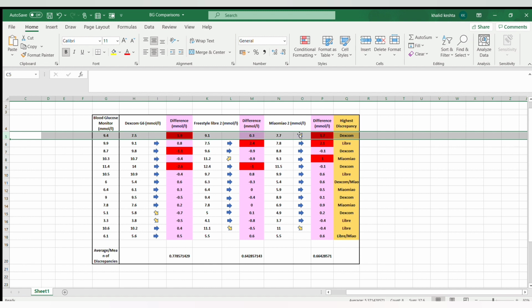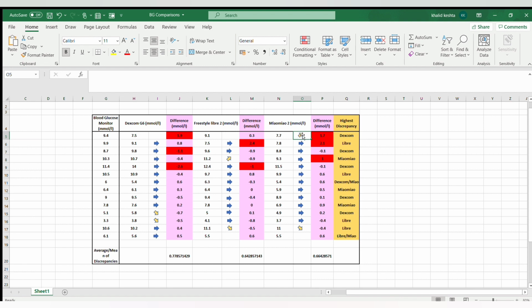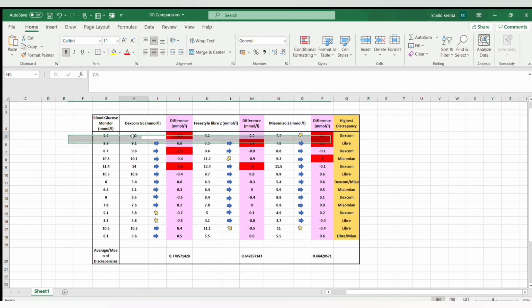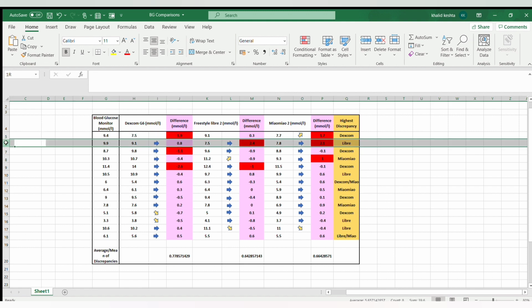But what the MIAOMIAO said is that the arrow is going up. So basically, as I said at the start of the video, the arrow dictates where this figure is going. So it's gonna go towards the 9.4. So the MIAOMIAO is safe here. So if I am to criticize any of these values, it would be the DEXCOM. That's only for the first value.